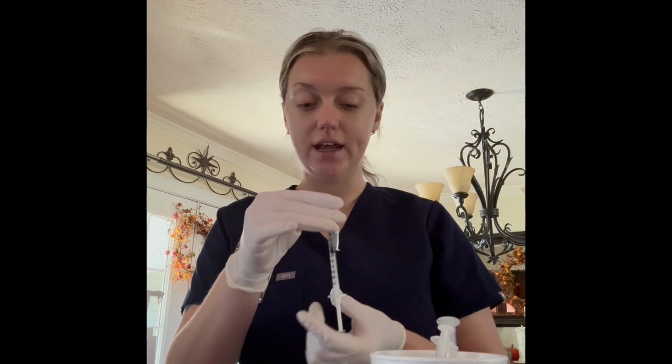So same thing for a subcutaneous injection, which is going to be at a 45 to 90 degree angle. I'm going to clean with an alcohol swab in a circular motion, allow that to air dry, and then I'm going to take my needle and uncap it in the OK position, and then I am going to inject this at a 45 degree angle, and I am going to stabilize it with my non-dominant hand, inject the medication slowly, remove at the same angle it was inserted, apply pressure with my non-dominant hand as I'm engaging the safety device with my dominant hand, and then apply pressure to the wound. And then same steps for the next.